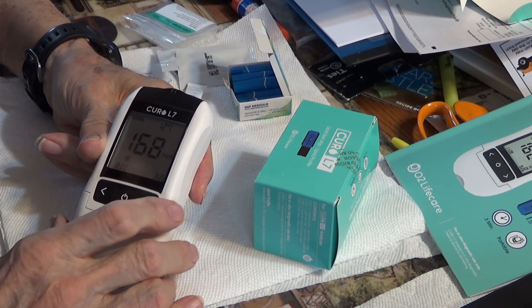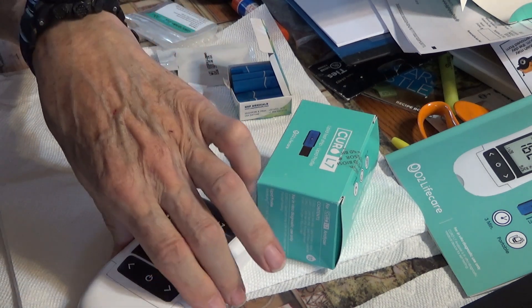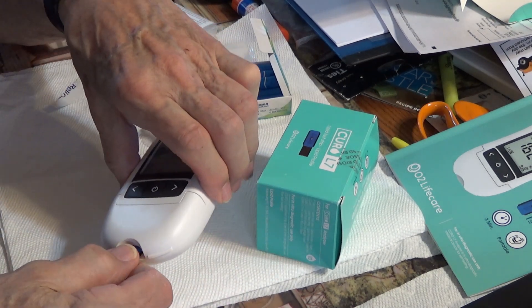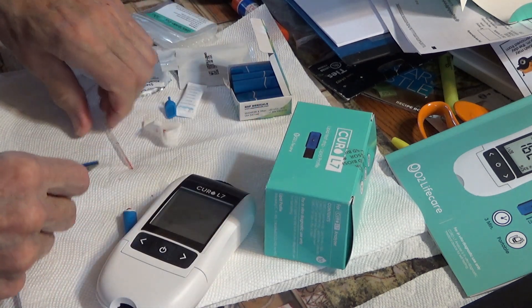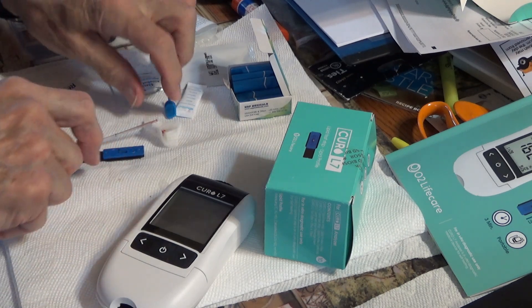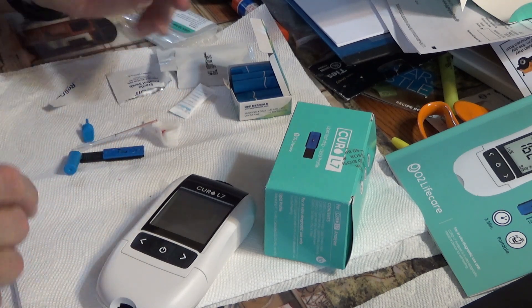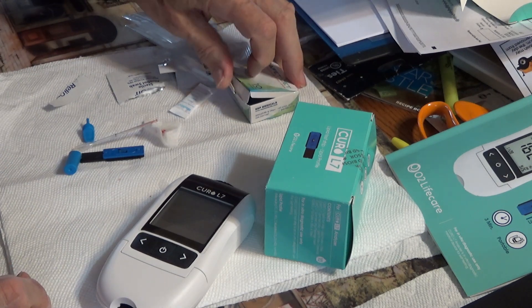Then you can take the strip out like that. You put all your stuff aside and get rid of it — throw it out properly.